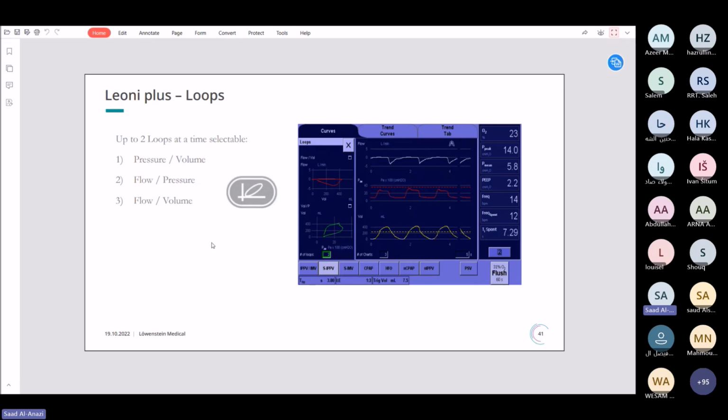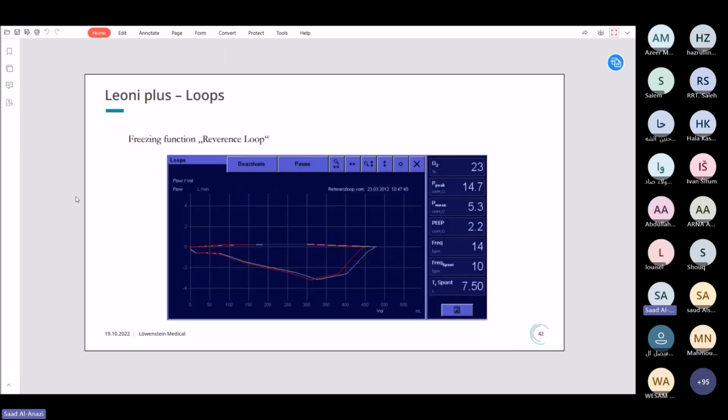So this one is really a good tool to continue measuring and monitoring your neonatal populations. As you see here, in the retrieving data or in the log flow, we have a reference. You can refreeze the functions of the reference loops. After freezing, you can measure it and analyze it. So this is a good tool to really assess your patients and check what is a good therapy for the patients.